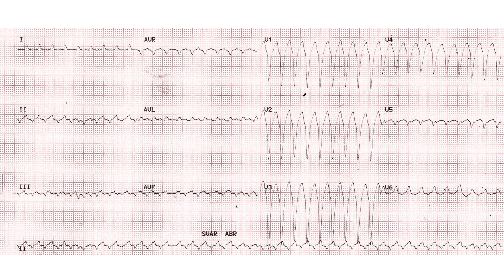Monophasic wide QRS complexes are seen from V1 to V5. V6 shows a positive wide QRS complex with LBBB morphology. Similar morphology is seen in leads I and AVL as well. The QRS voltages are low in limb leads.